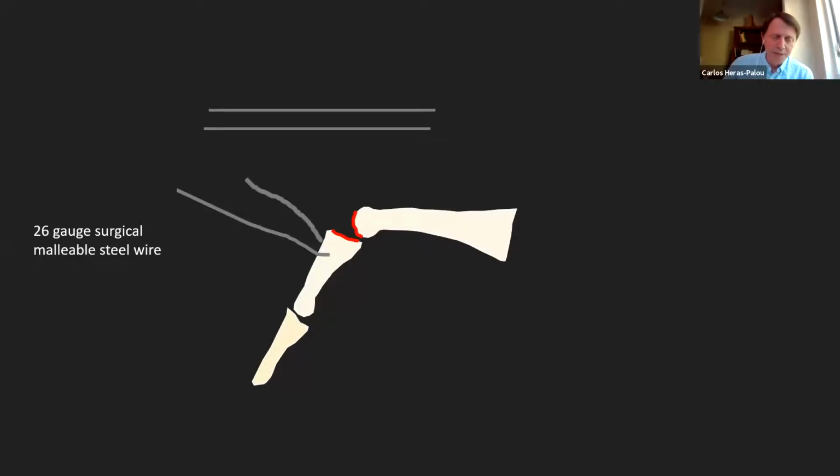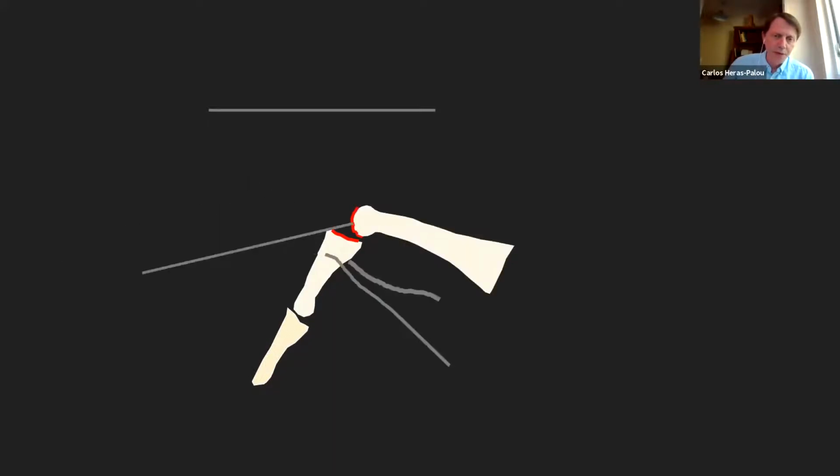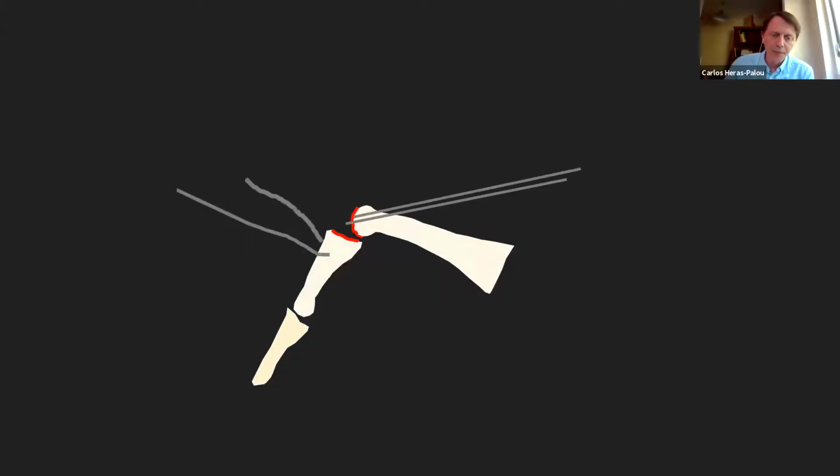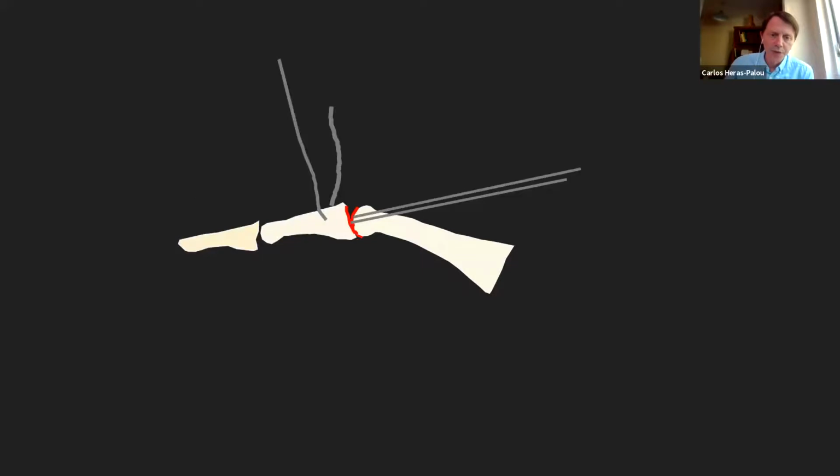So get that, pass it through the middle phalanx, and then get your K-wires and pass it into the bone. Just realize that this is going to determine the angle you're going to do your arthrodesis. So pass it there, and then you are committed to that angle. Pass the other one as parallel as you can. If you have them parallel, then your compression will allow the two bones to come together. If they are not parallel, it's more difficult to slide because it locks you into that position. So as parallel as you can, and then you reduce that at the right angle and just push them in.